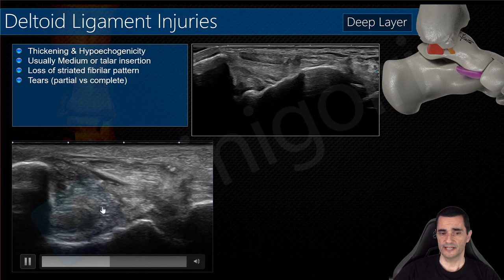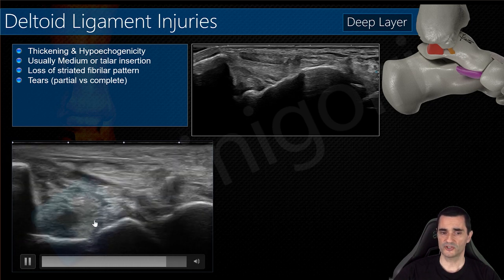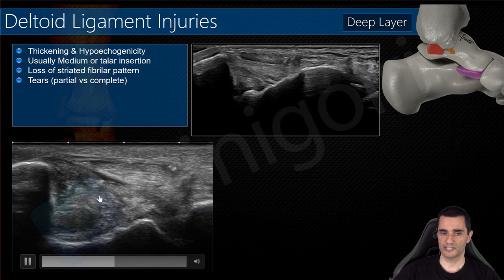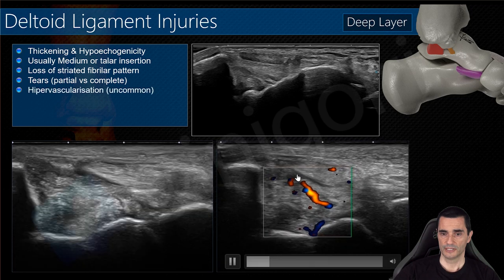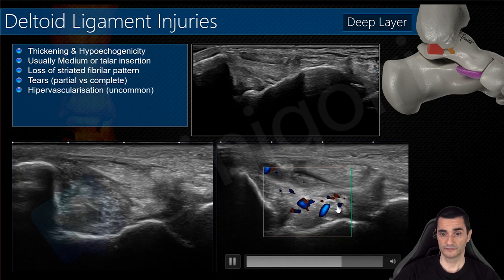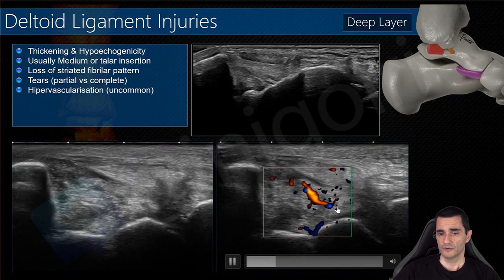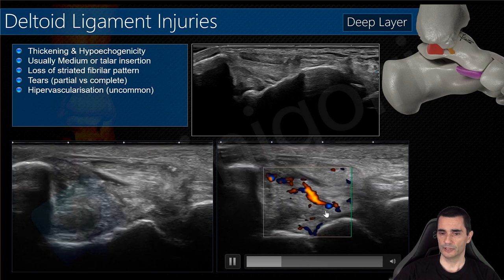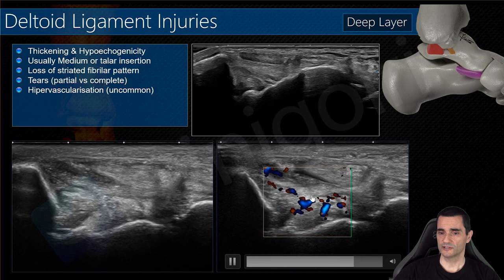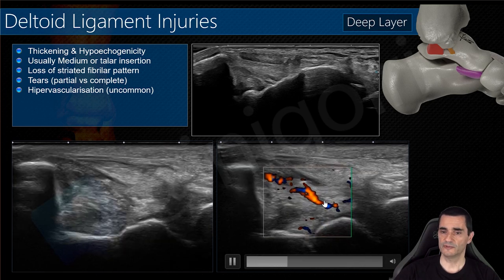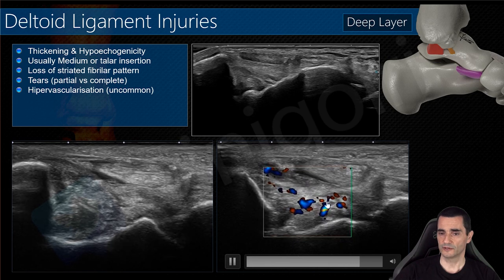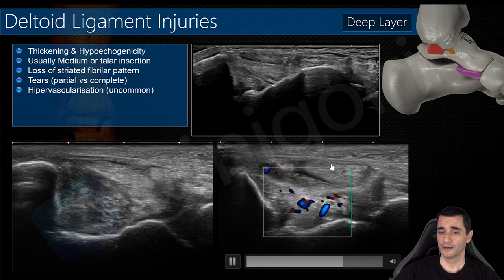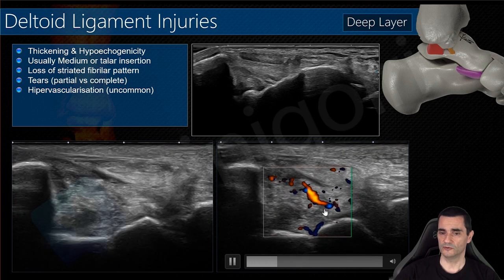We will often find tears inside the ligament. This is an example of a partial tear of the deep area of the posterior tibiotalar ligament and its vascularization on Doppler. When checking vascularization, always remember to avoid stretching the ligament before performing Doppler, because if the ligament is stretched the Doppler signal will not be present. Also, don't push with the probe because you will collapse the vessels.